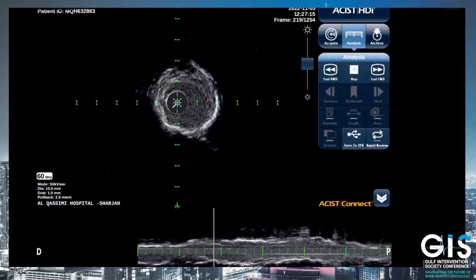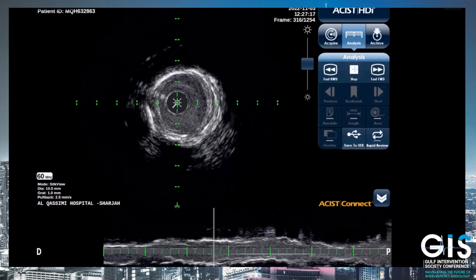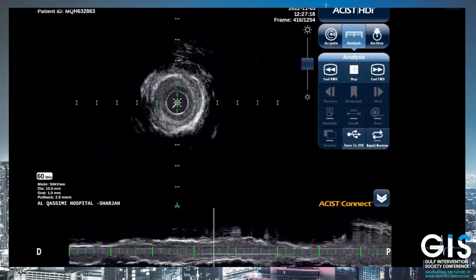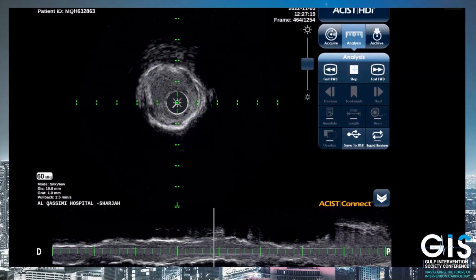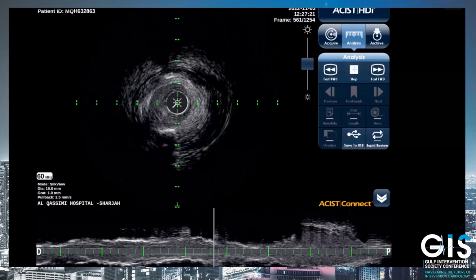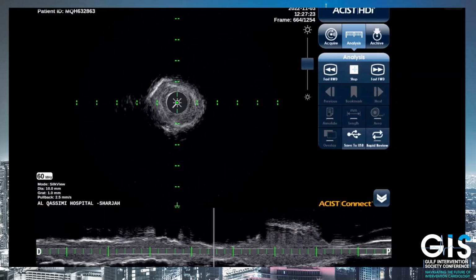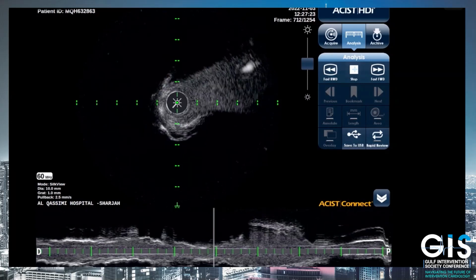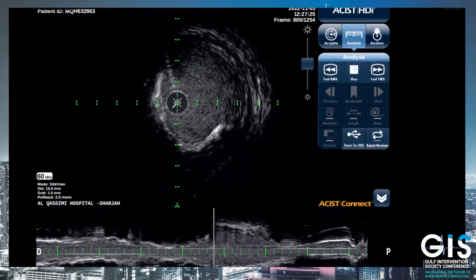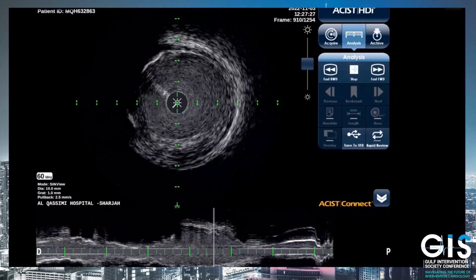So starting from the proximal part of the LAD, which was previously stented, coming back to the ostium, we have the stent, and this is back, and here comes the ostium of the LAD, and as you can see, it's a heavily calcified ostium. IVL can do the job here. Yes. Good cross. So I think IVL should not be a bad option.